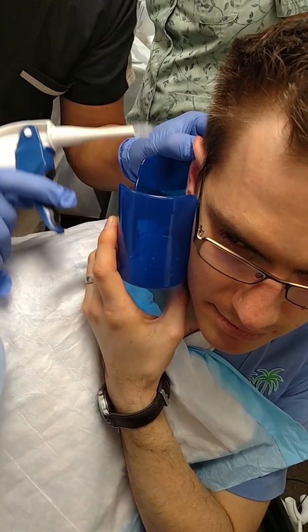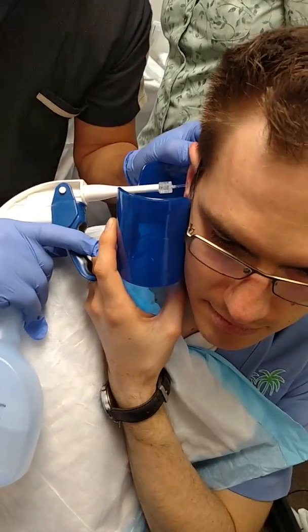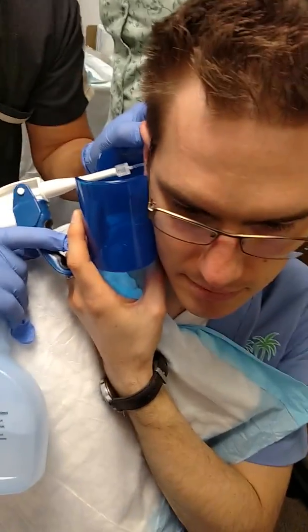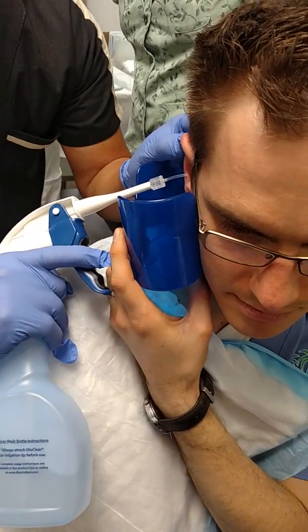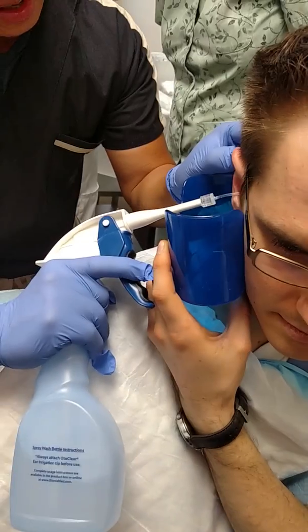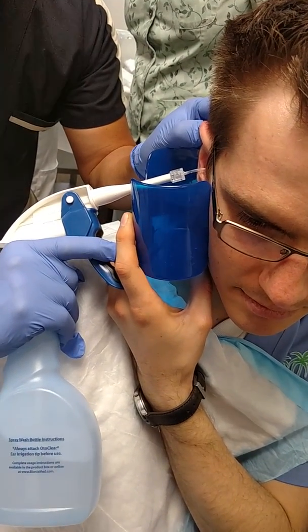So when you're doing your externship, you want to make sure that you perform it with the instruction of your preceptor first. Watch how they do it. We're not going to do it live here because we're not allowed to do it. But in the real world, when you start, this is the position. Straight up, point to the roof of the ear canal, then start pressing.